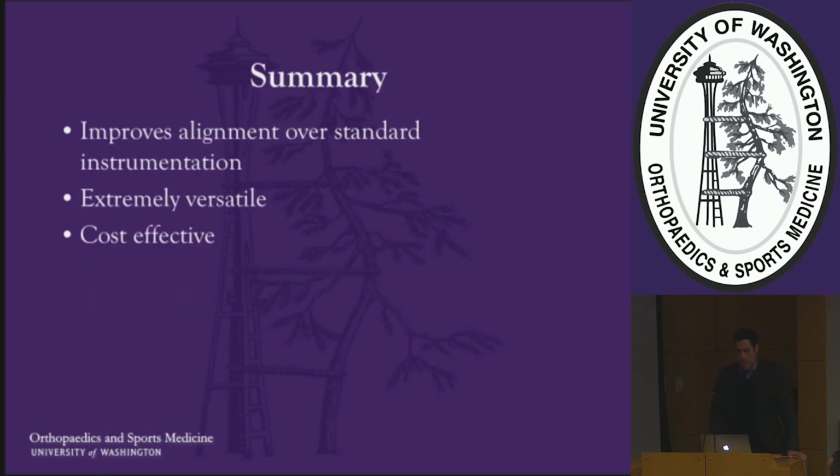So in summary, I think accelerometer-based navigation provides us with a tool that allows for improved accuracy and fidelity of our cuts. It's extremely versatile. You can use it with any system you want. I believe that it's cost-effective if you're decreasing your revision burden, especially in younger, more complicated patients.